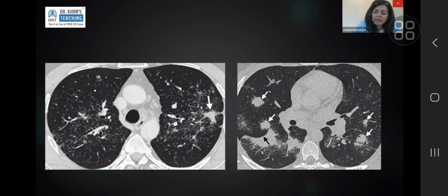You can have calcified lymph nodes or fibrosis and not have active disease. Fibrosis will always be fibrosis, even if it's stable and stays exactly the same severity for the next 20 years. It's not classified as active disease. If you have lymph node enlargement that is calcified and stable, it's not called active disease.